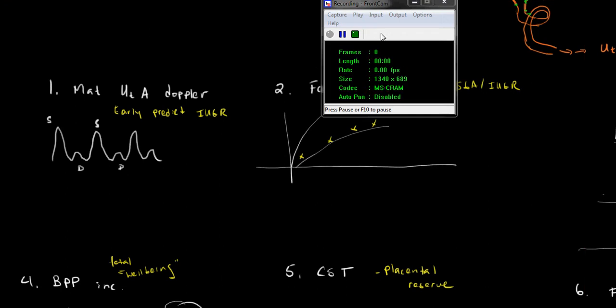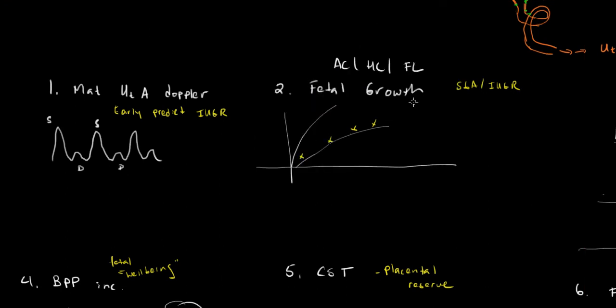Hi, this is David, and in this tutorial I'm going to talk about the way we could monitor a fetus in utero. And I'm going to sort of conflate or put together things that are used for intrapartum monitoring, which means monitoring during labor and delivery, and antepartum monitoring, and I'll sort of smush them together a little bit.